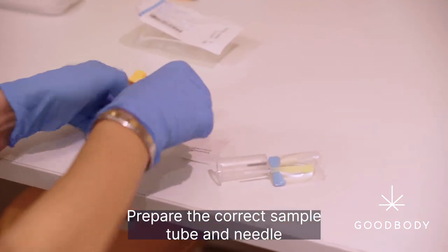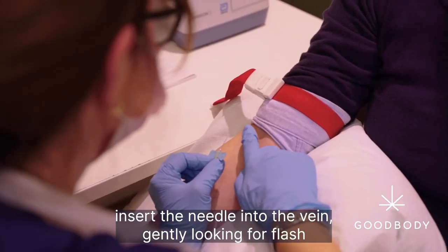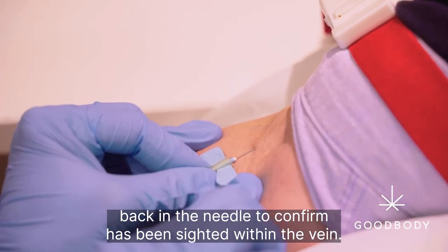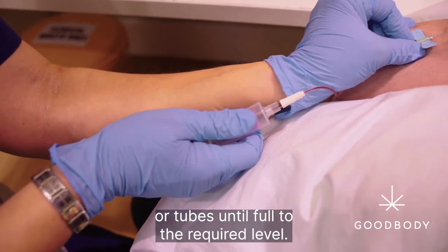Whilst drying, prepare the correct sample tube and needle. When ready, insert the needle into the vein gently, looking for flashback in the needle to confirm it has been sighted within the vein. Gently withdraw blood into the tube or tubes until full to the required level.